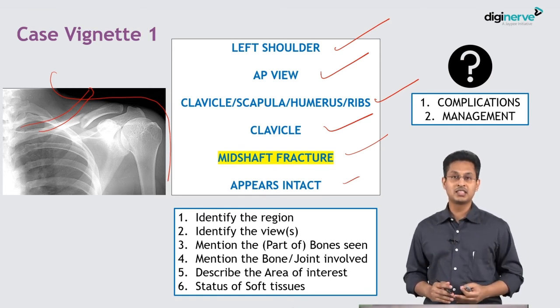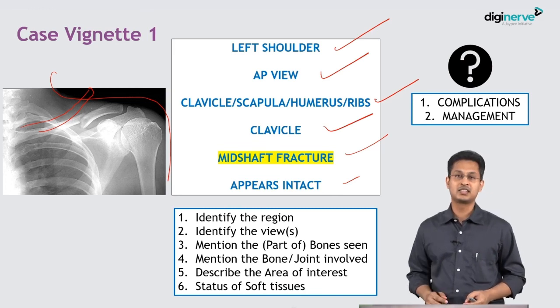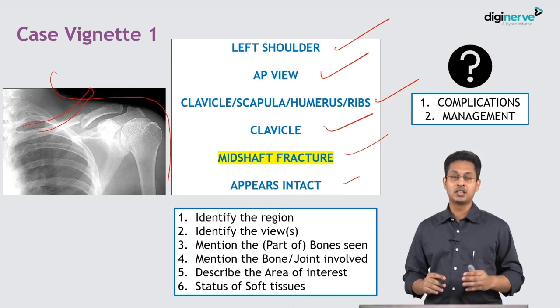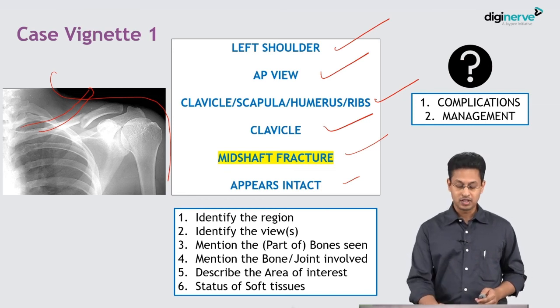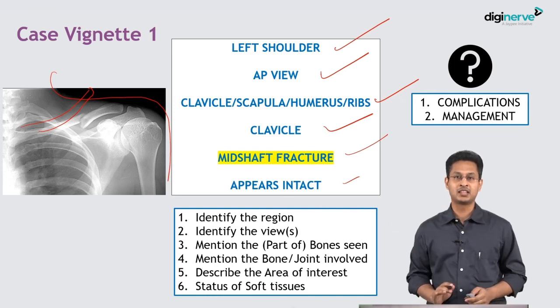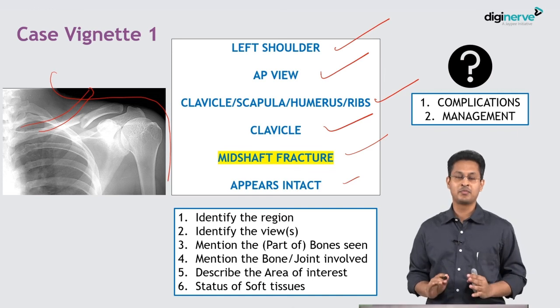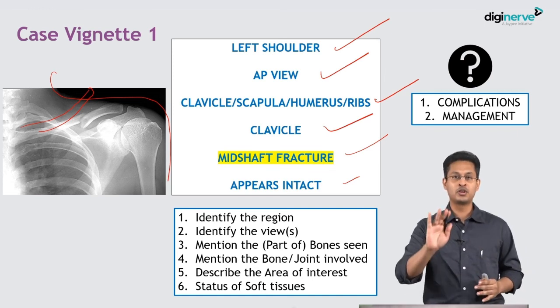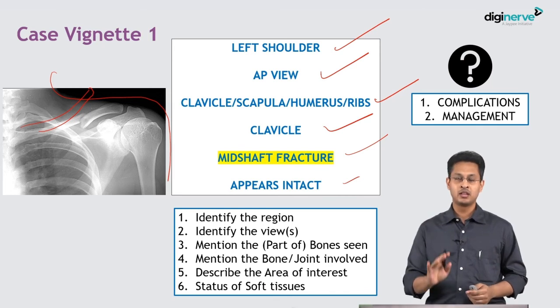The third is that any fractured bone usually has neurovascular structures in the vicinity, so they are also vulnerable to being injured or damaged. So for any X-ray showing a fracture, the four potential complications you can describe easily are malunion, non-union, neuro injury or vascular injury.